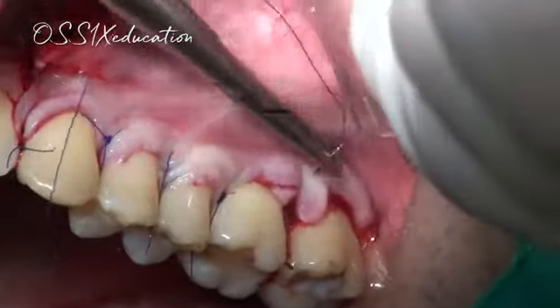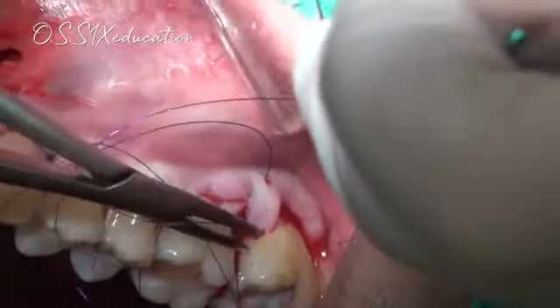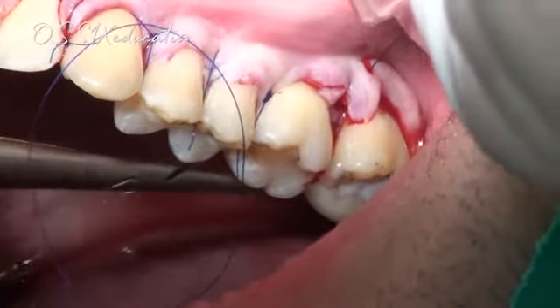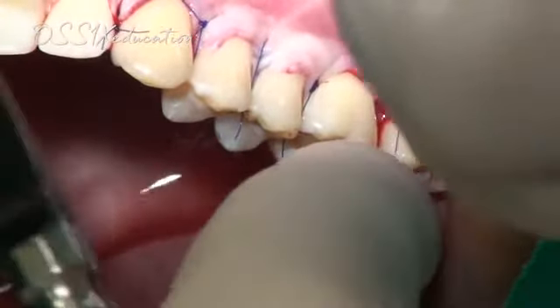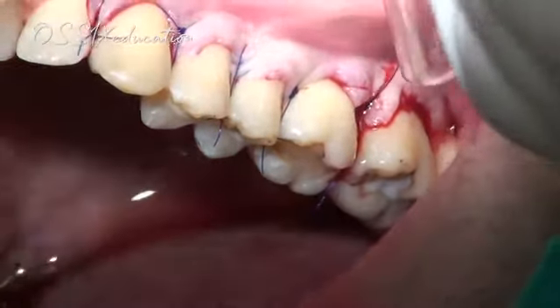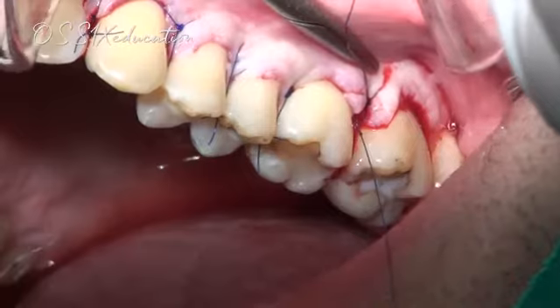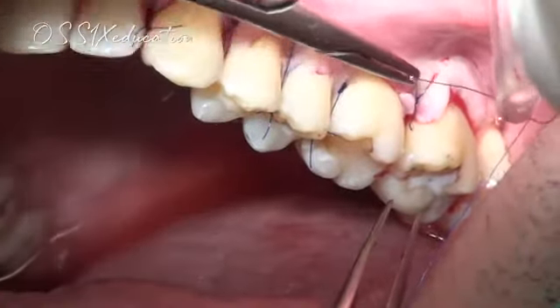Now this is the last suture. Hopefully the last one. Never know. Okay, the patient is almost falling asleep. We can hear him snore a little bit. Maybe he's not, but it certainly sounds like that.